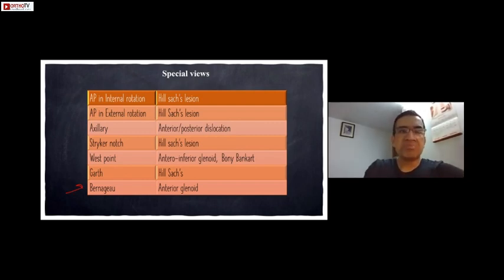I have stopped doing them in my personal practice for the last 8 to 10 years. I just don't do any of these, except, yes, the axillary view, continue it. The rest of the things are now gone. It's all based upon the CT scan.